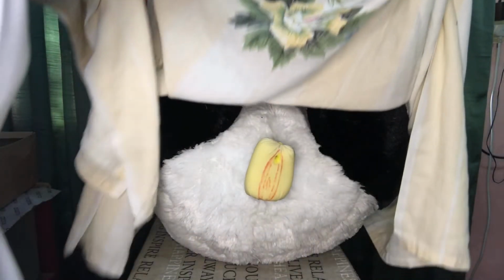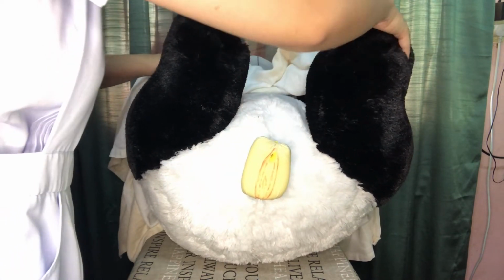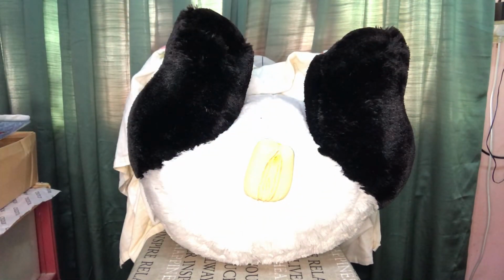Position the client in dorsal recumbent position with feet about 2 feet apart, then drape. Slide the waterproof pad under the client's buttocks. This position will give us easy access during the procedure and will make her feel comfortable.